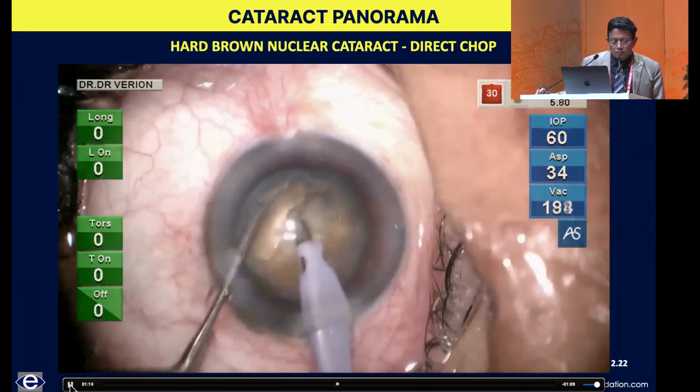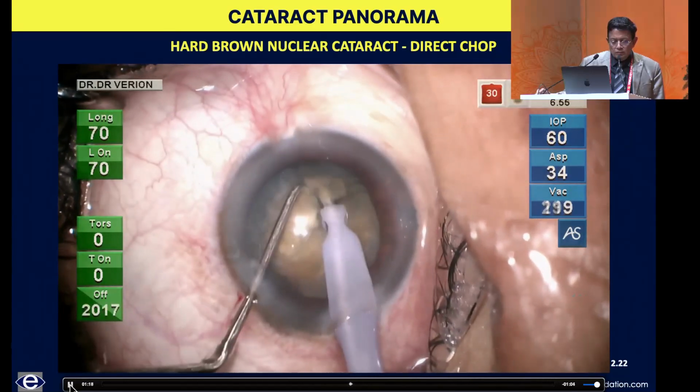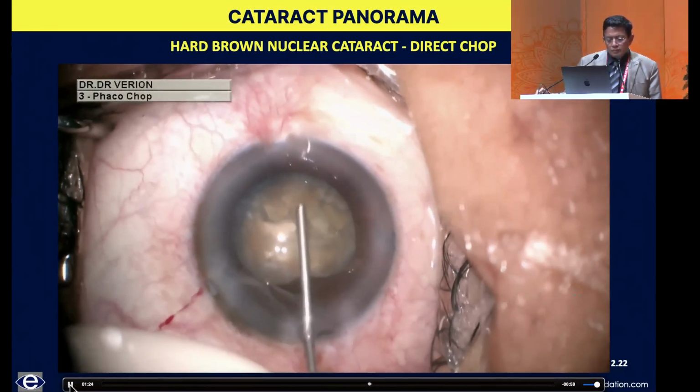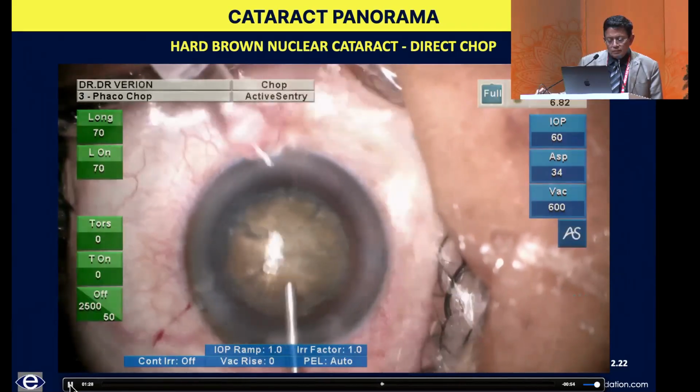And like you, I kind of do all the chops in situ if I can, because you get the sort of interlocking puzzle piece effect where things are stabilized. You're going to put in a little more viscoelastic now because you're replenishing it.